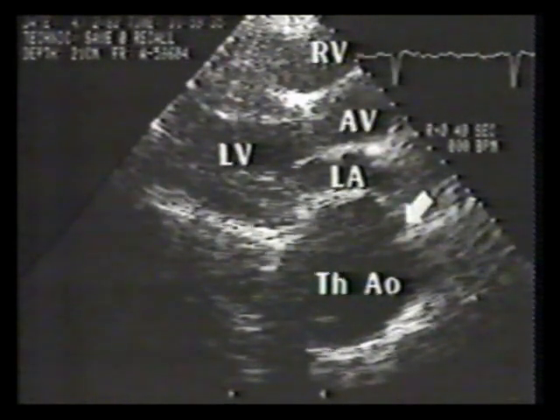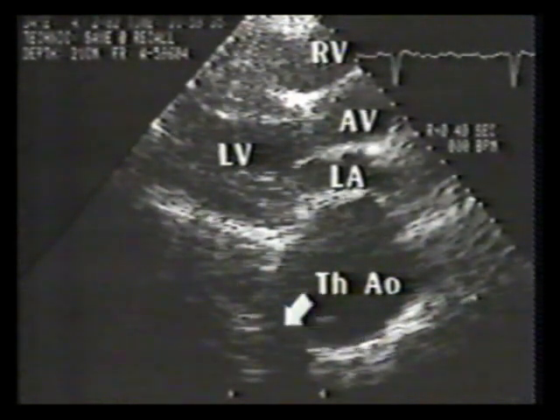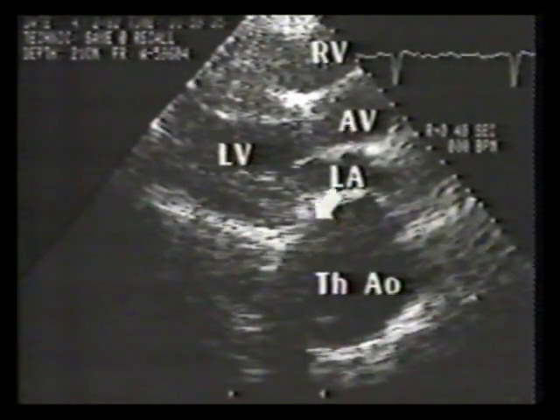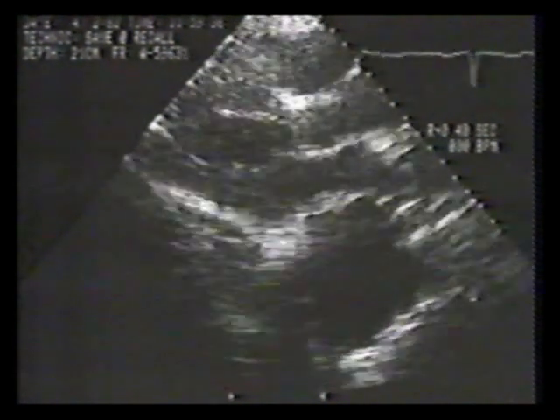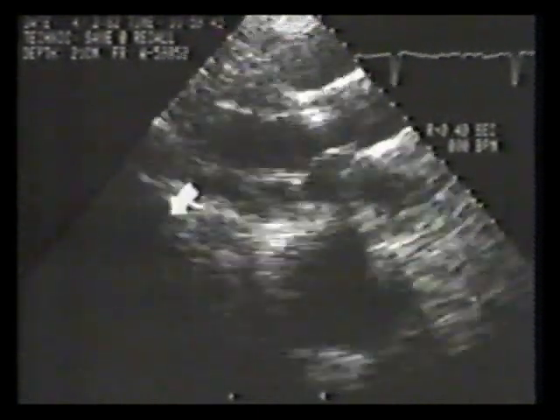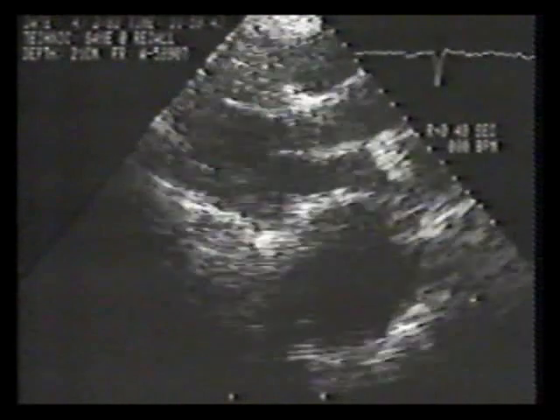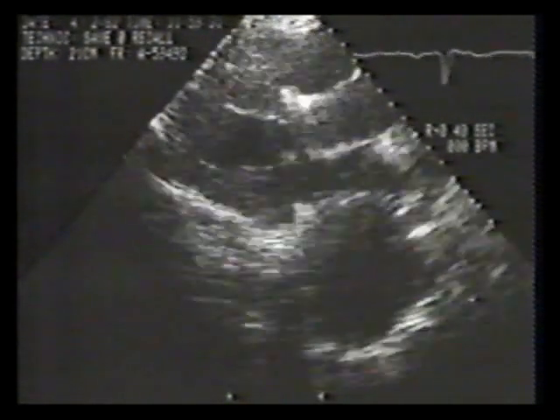In the parasternal long-axis scan, the large thoracic aortic aneurysm is located posterior to the left atrium. One mechanism of identifying this as aorta is to attempt to image the aorta in long axis. Transesophageal echocardiography, however, is a more diagnostic procedure and would delineate aortic aneurysm from tumor.